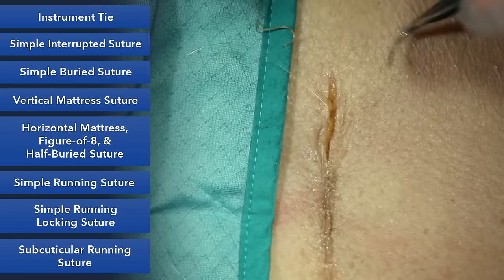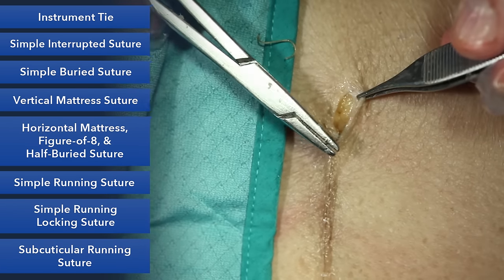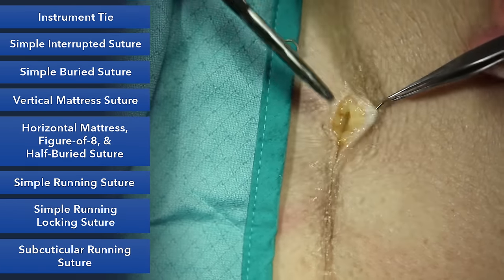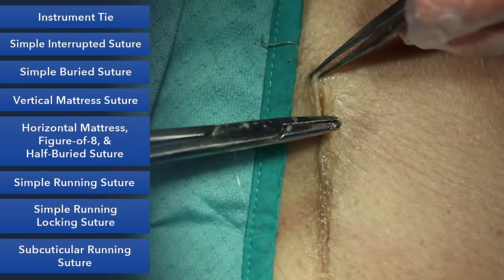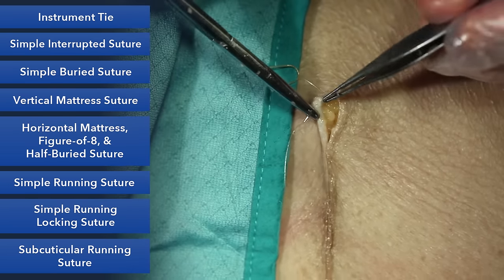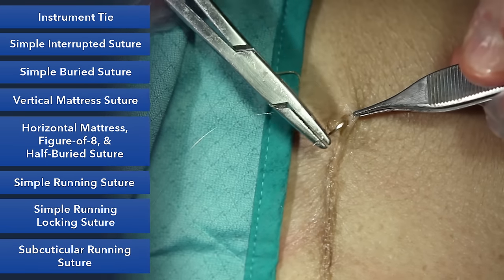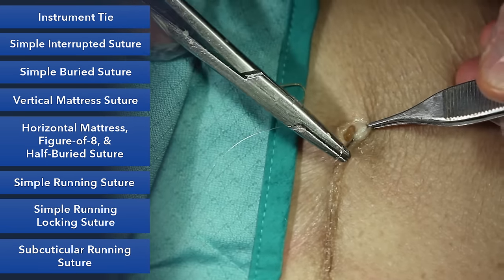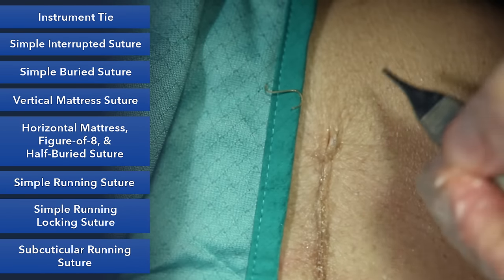And just like when we started, as you begin to approach the corner, you want to stop taking such big bites and start going to some smaller bites because you really want these skin edges to be well approximated at the corner and not create any dog ears. We also want to bury our knot. So if we're going to bury our knot, we have to start thinking now about getting deep with both of the two ends that are going to get tied.